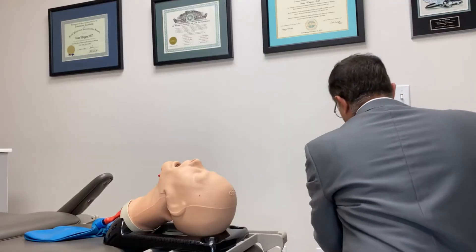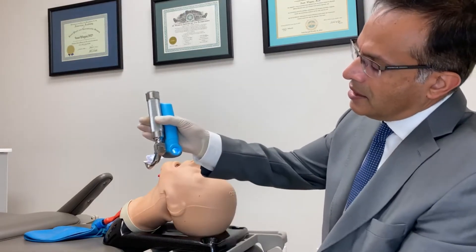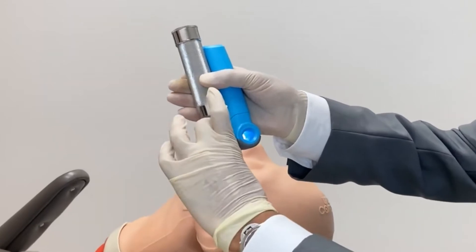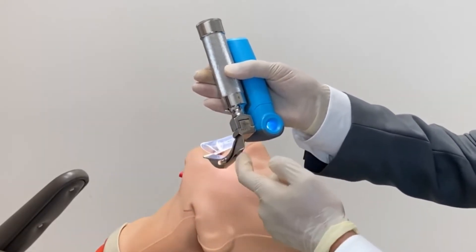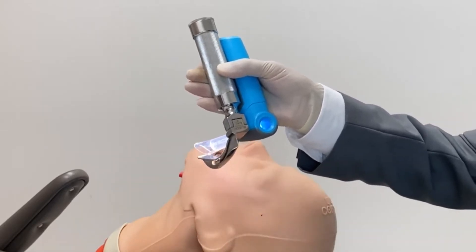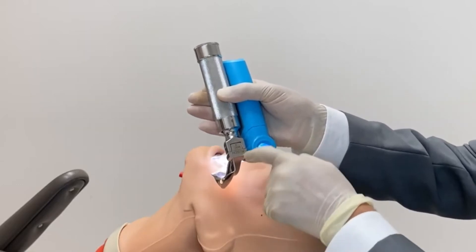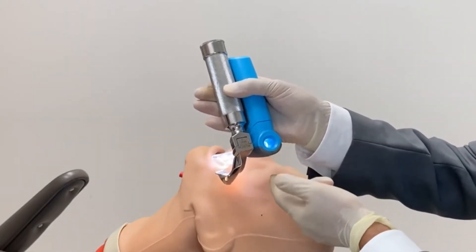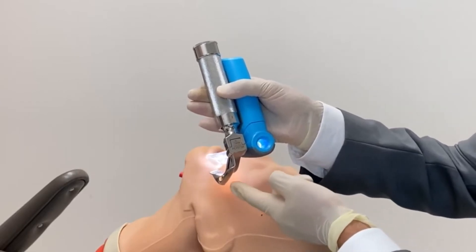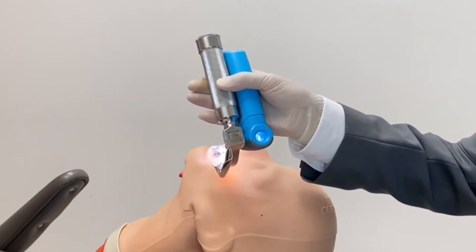For our v-scope, the rubber tooth guard is already integrated on the scope. When you look at the two devices together, there's a clear difference in profile — the Macintosh is really high, whereas the v-scope is much shorter, so there's no extra part to strike against the teeth. There are no sharp edges; it's rounded, and plastic or rubber against teeth is far less likely to cause damage than a sharp right-angle metal object.